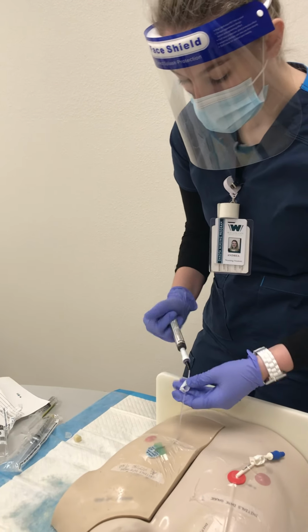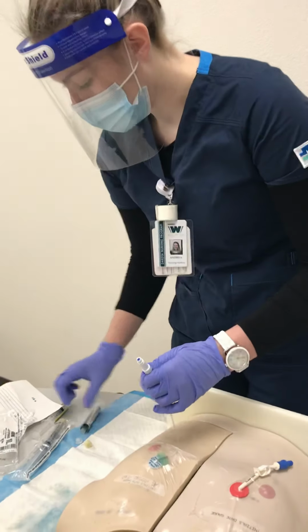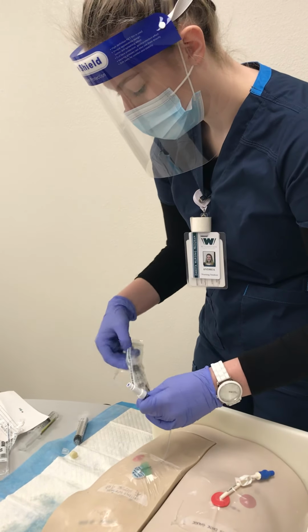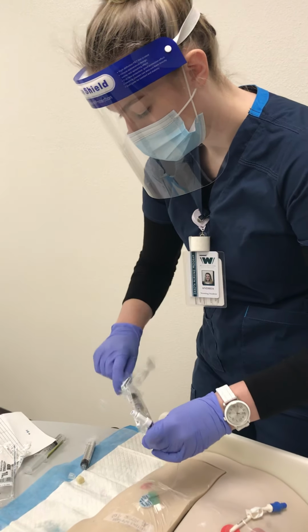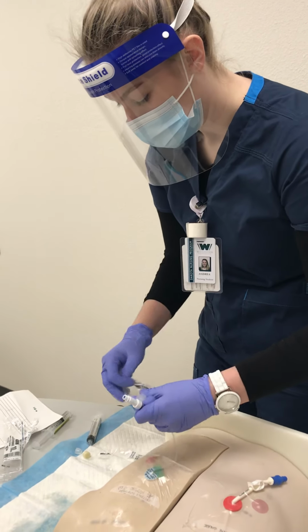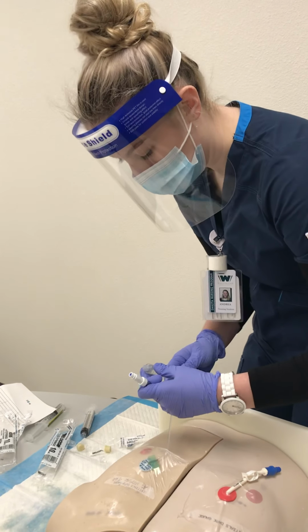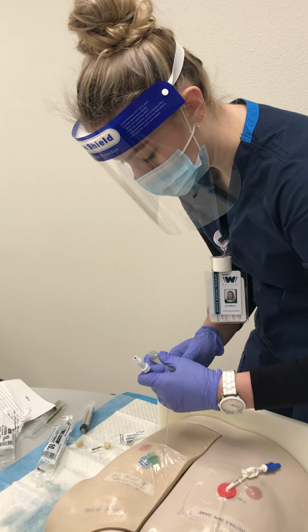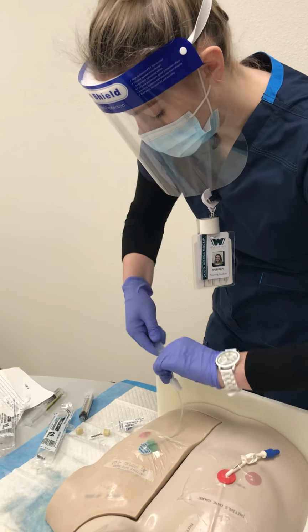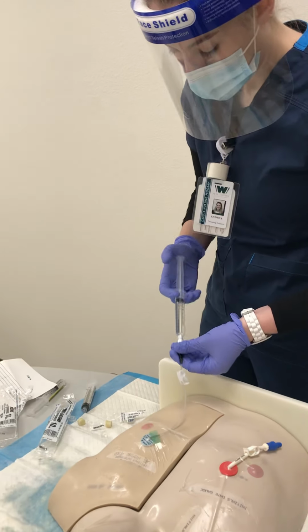So once that's administered, I'm going to clamp it again and take this off, and now I need to flush with normal saline. Attach that once the air bubbles out, and unlock and push pause again.